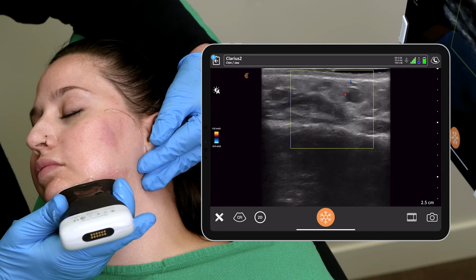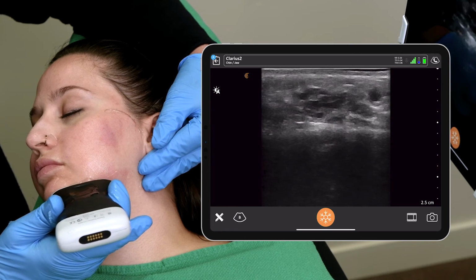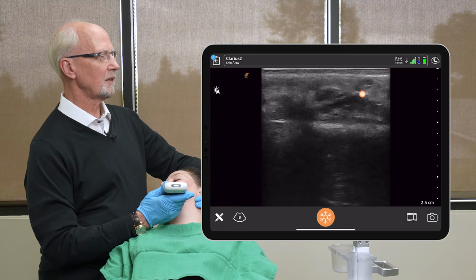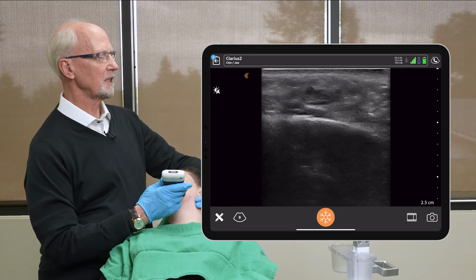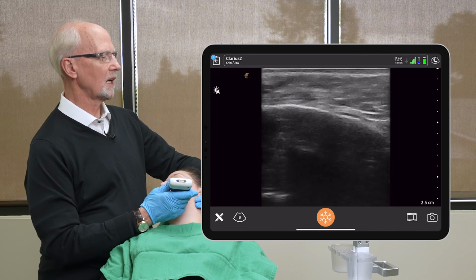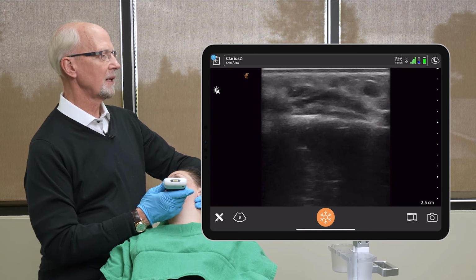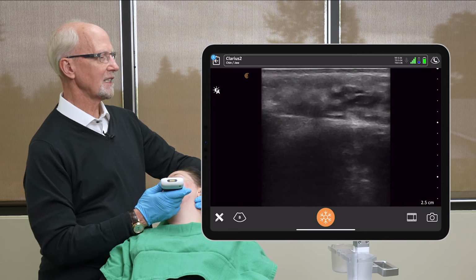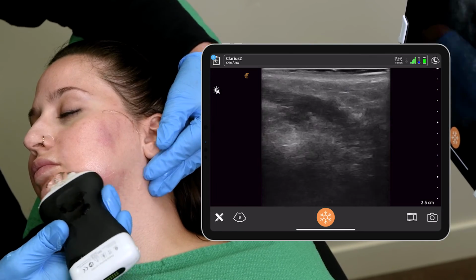We're just going to look along the mandible, color mode. So we can see our product here in the space above the mandible, which we see as this white band. We see product which is along the mandible, starting about here at the labiomental fold. We can see our product in place, that it is as aliquots rather than as simple bands or threads.